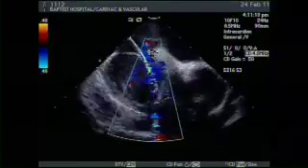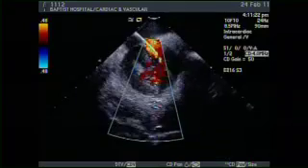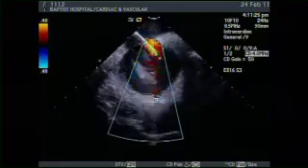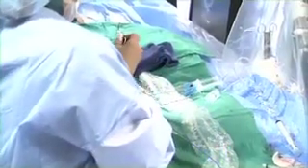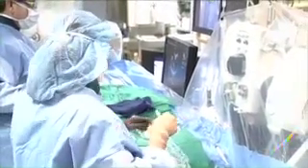Can you put color in that image? Let me see if I'm at the appendage on the left atrial appendage. All right. Can I have the multipurpose? We're going to reposition our wire in another place to make the procedure safer. It's important, safety is of the essence in all these procedures.